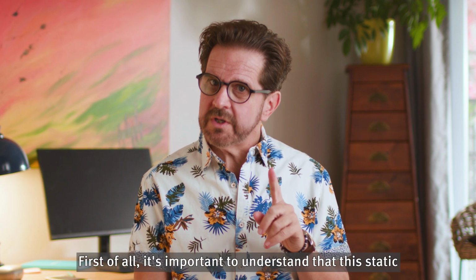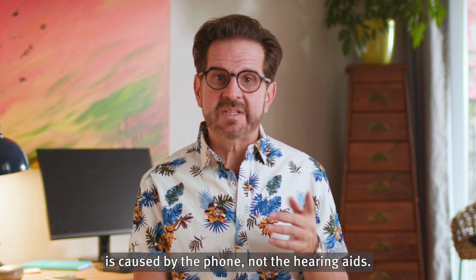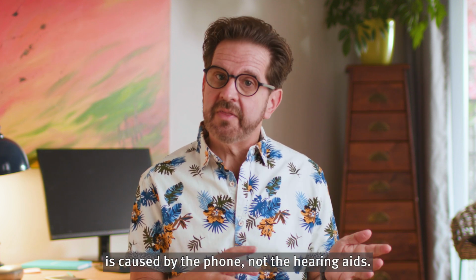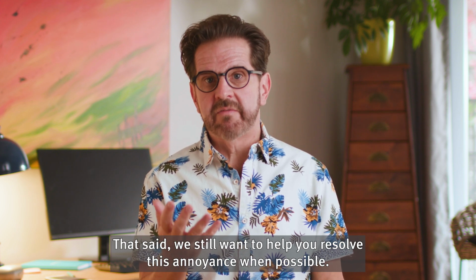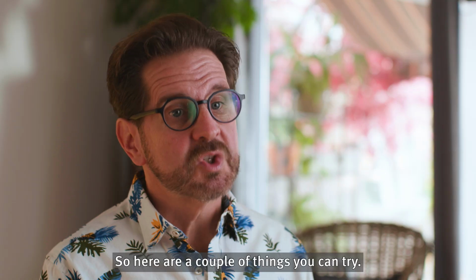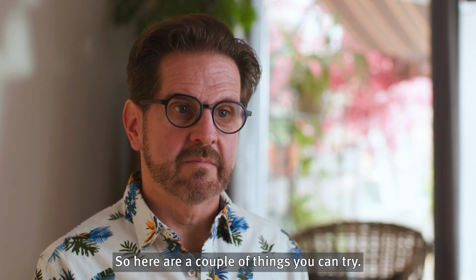First of all, it's important to understand that this static is caused by the phone, not the hearing aids. That said, we still want to help you resolve this annoyance when possible. So here are a couple things you can try.